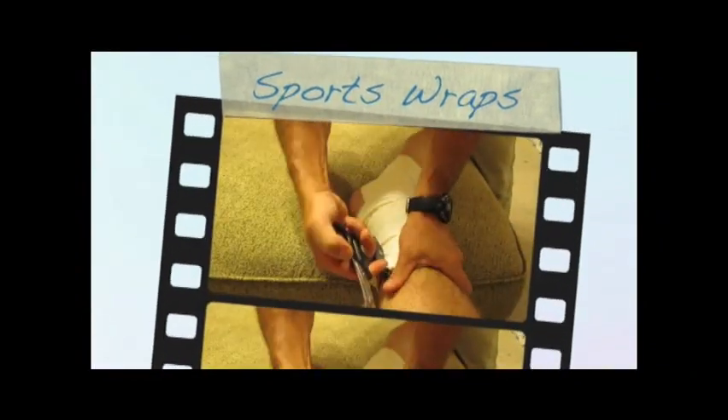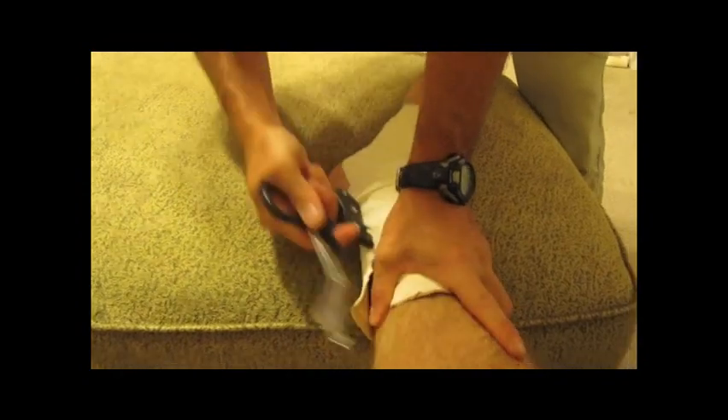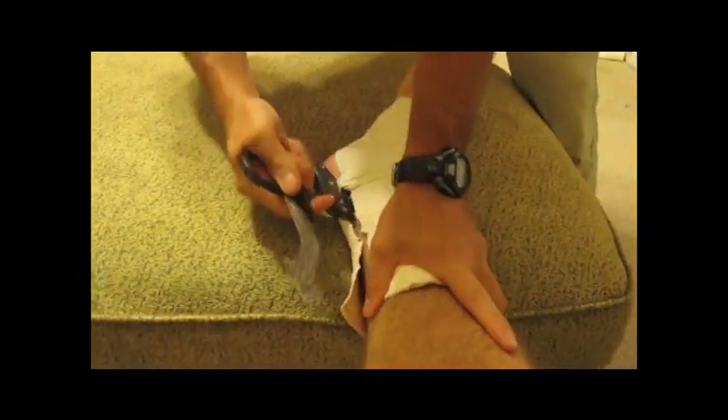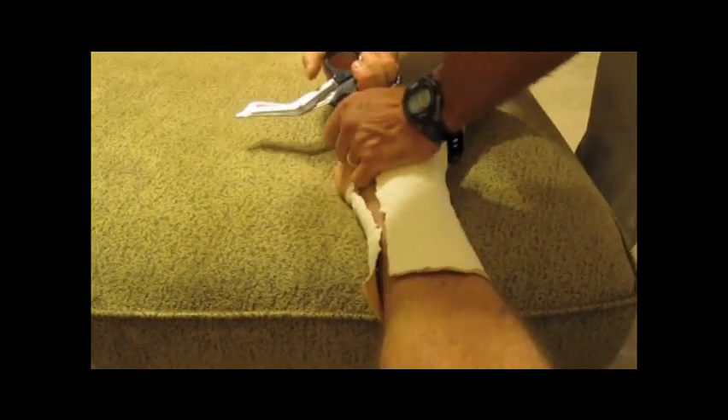Our next demonstration is on a sports wrap. See how he slides the guide and then in a rocking motion removes it, much like opening a tin can. As the medic pulls up and away from the patient, it makes it much more comfortable.